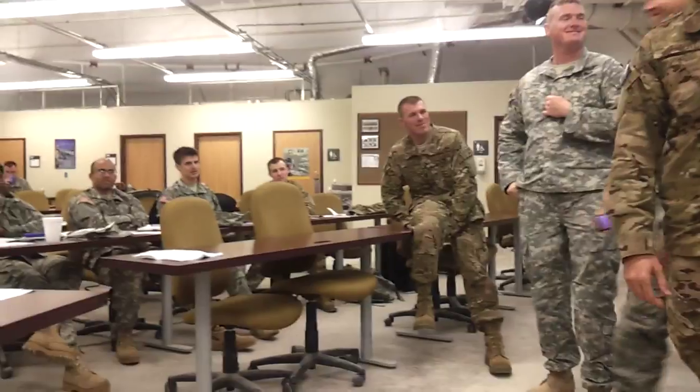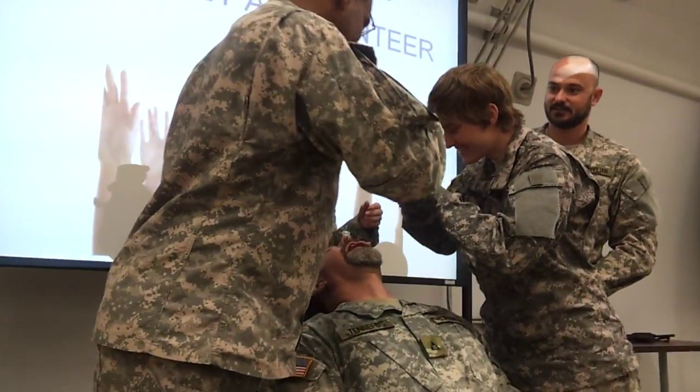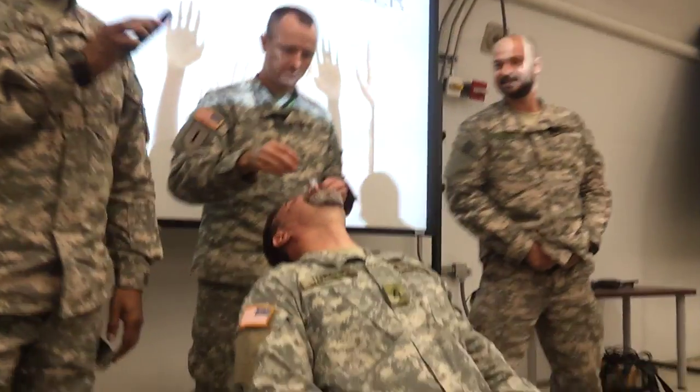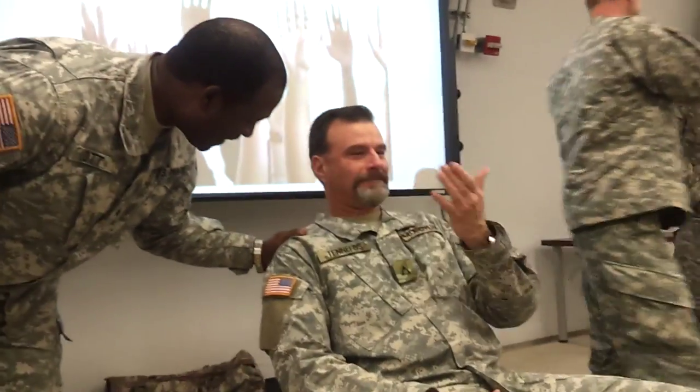When you're done and you want to take this out — one fluid, smooth, easy motion. Pull it out. Take it out. There you go. A little bit. I've done it before that, so I could have... I want to go — you've got a little bit.